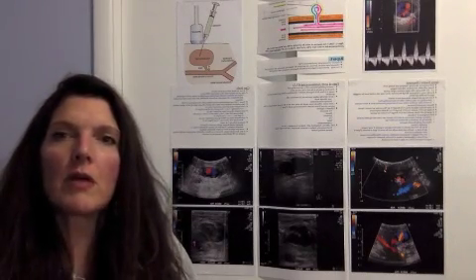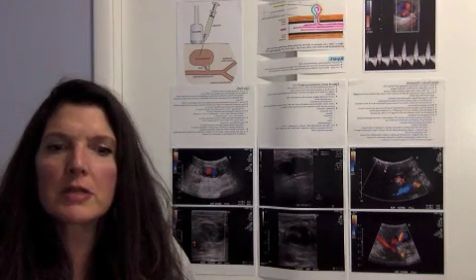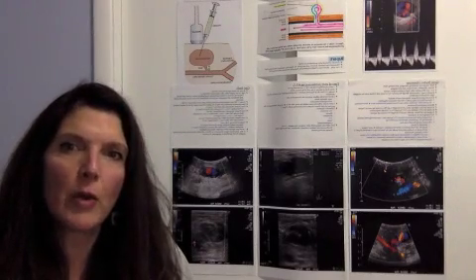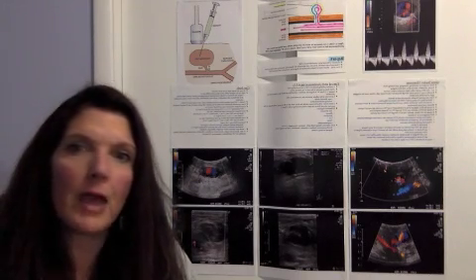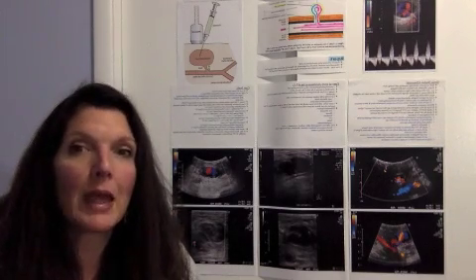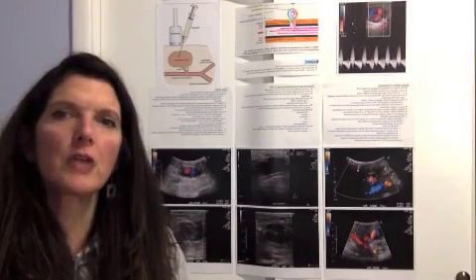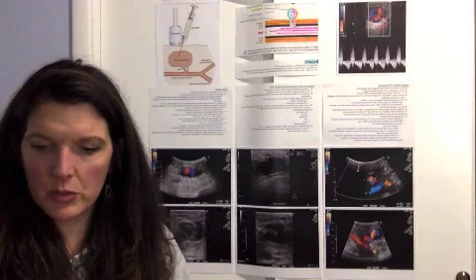Once the thrombin is injected, you can turn the color flow back on to check and see if blood flow cessation has occurred, and then also evaluate in B mode again for evidence of thrombus. If the thrombin injection procedure doesn't work, a patient may need to have a surgical treatment of the pseudoaneurysm. The case study I chose was an 86-year-old female with severe aortic stenosis.